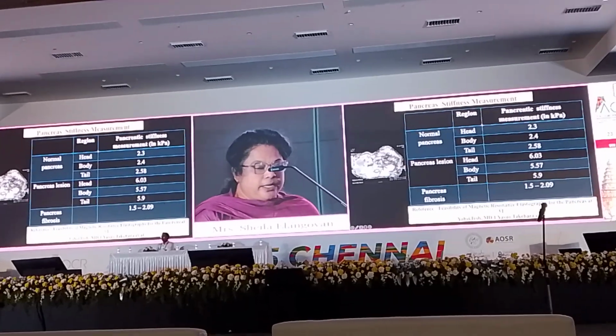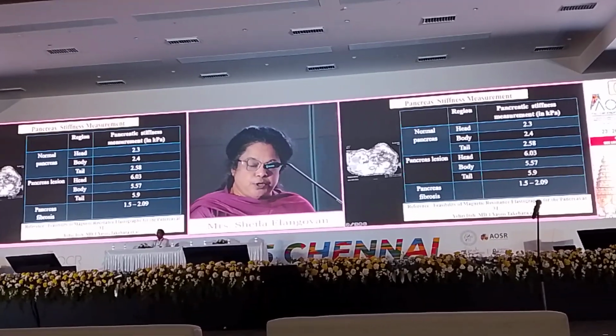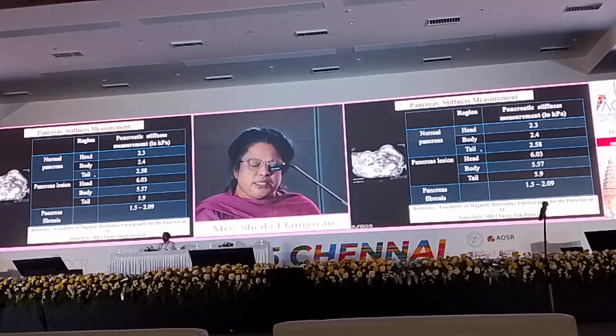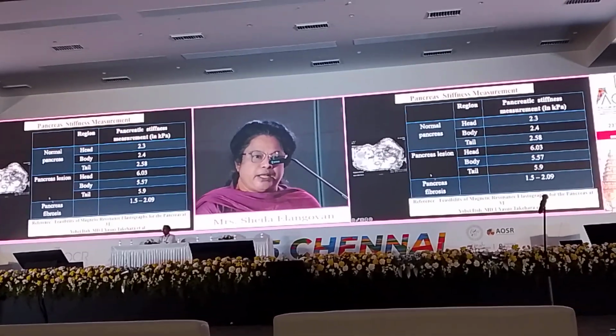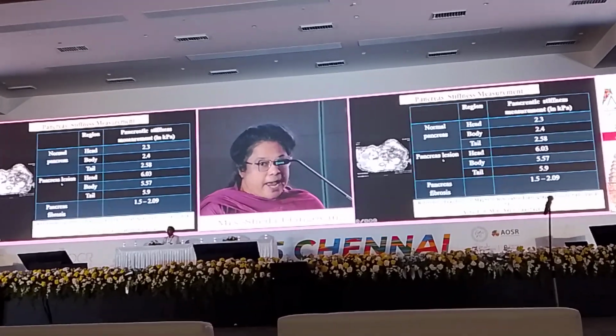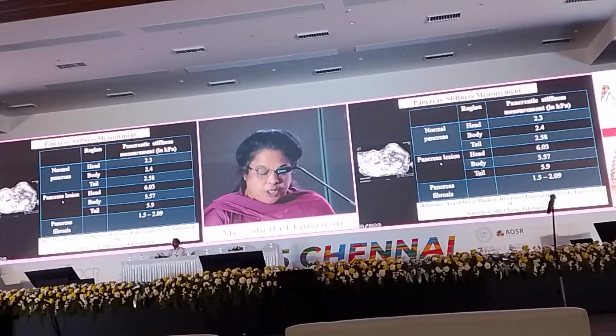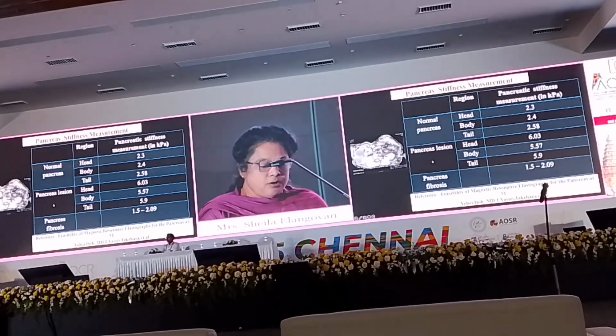Similarly, pancreas measurements are also taken. We could also do it in the breast, brain, lung. The technique varies slightly. The pancreas also depends, it's in an orthogonal plane. So you need to carefully place the driver, and your planning is very, very important. For the liver, see that you cover the major portion of the liver when you draw your ROI.